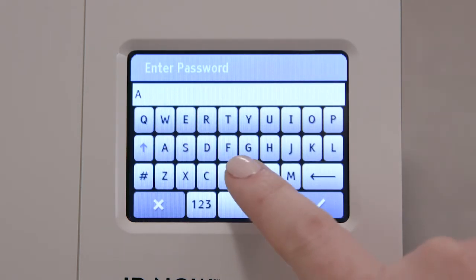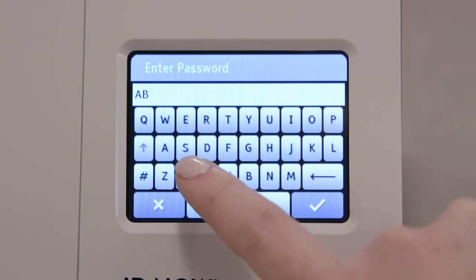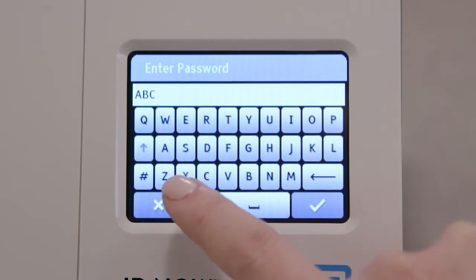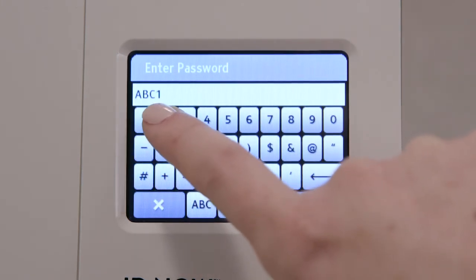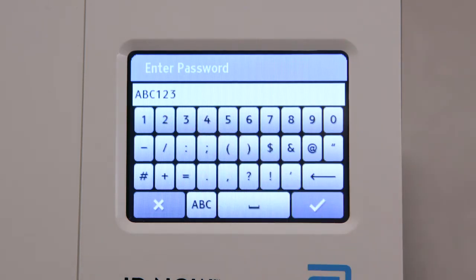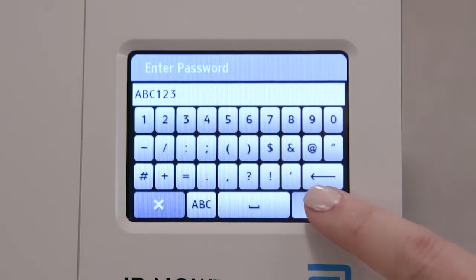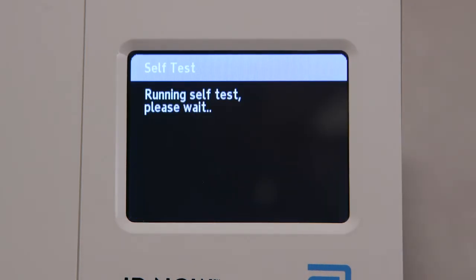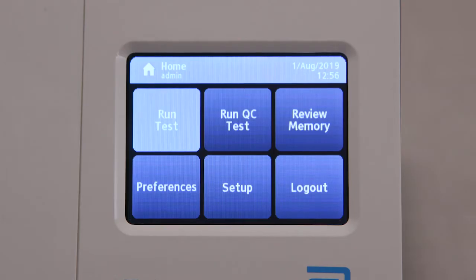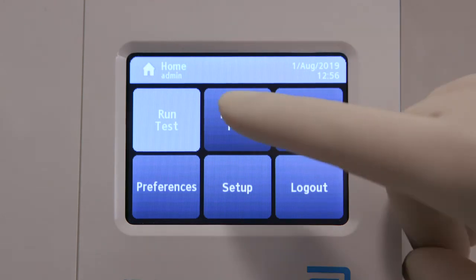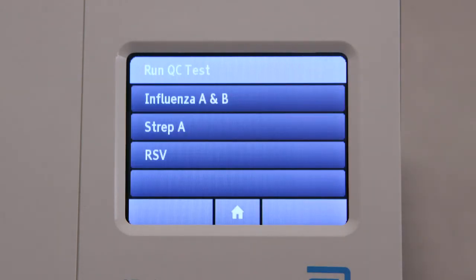If a password is required, you will be prompted to enter it. When entry is complete, press the check mark to advance. The instrument will automatically perform a self-test. Once the self-test is complete, the home screen is displayed. Now select Run QC Test.